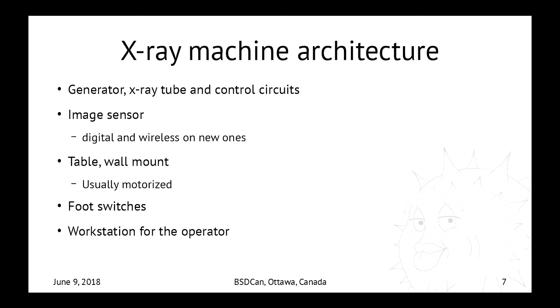It gets better. There are more components, well, not on the small mobile units, but in the fully equipped X-ray rooms. There are usually tables, wall mounts, stuff like that, and all this stuff is motorized. And interestingly enough, the control systems, I'm not saying circuits, the control systems for that have to have some real-time capabilities so that the table doesn't drive off the table stand. Well, there's supposed to be some mechanical block, but they have to have some real-time.